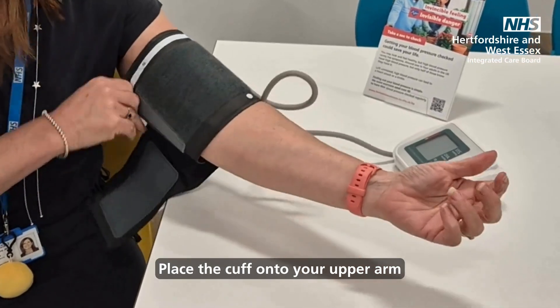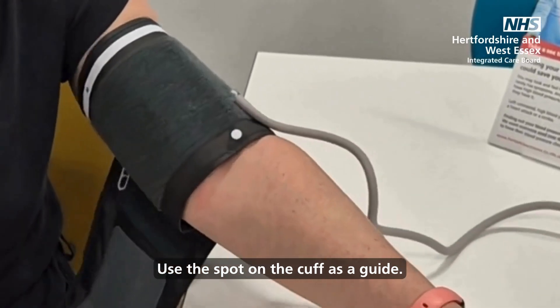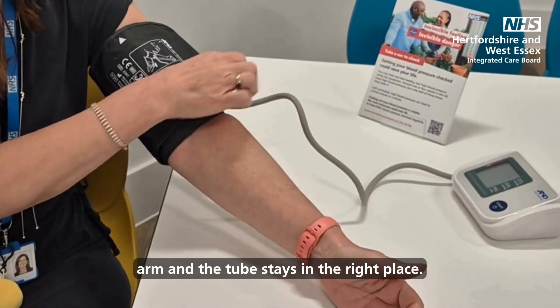Place the cuff onto your upper arm with the tube pointing downwards. Use the spot on the cuff as a guide. Fasten the cuff so it fits snugly on your upper arm and the tube stays in the right place.